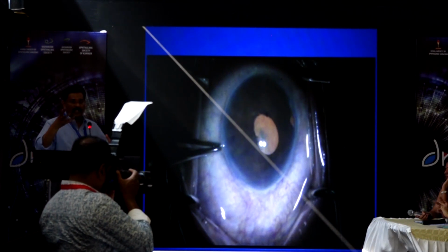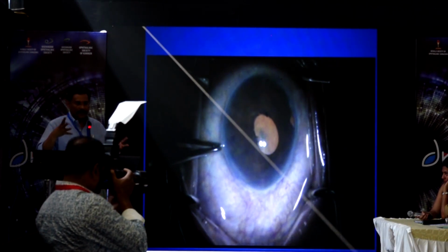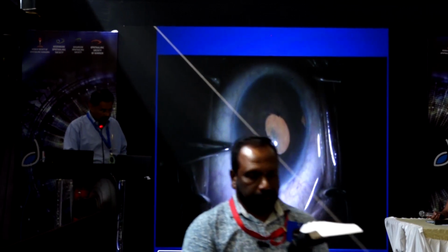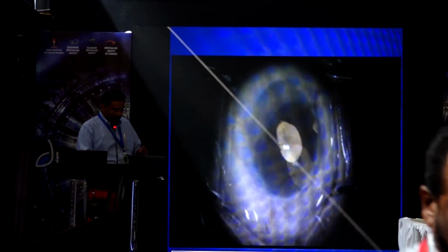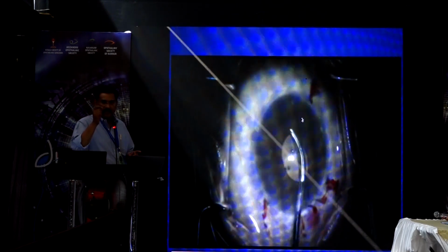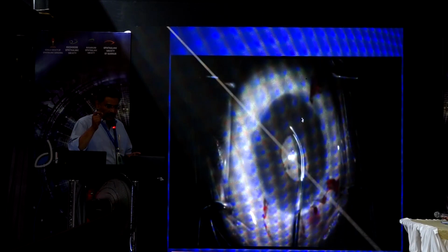So don't buy these thick blue ones which some companies make. I don't have anything against companies, but those very thick ones need very large openings. So here again you see fibrosis. This is the point which we have to identify. Identify where the fibrotic margin is and make a small nick.